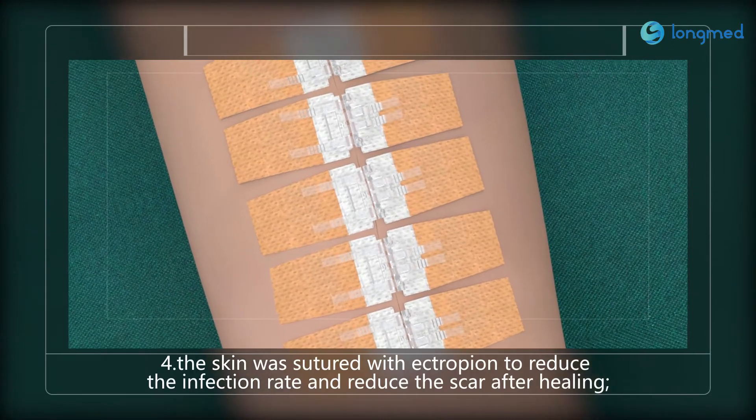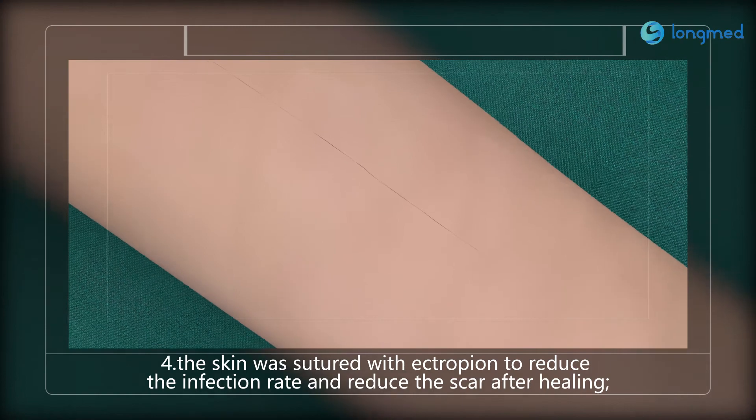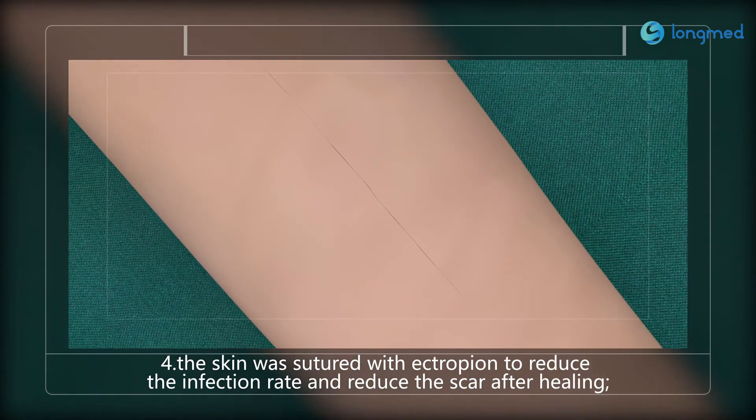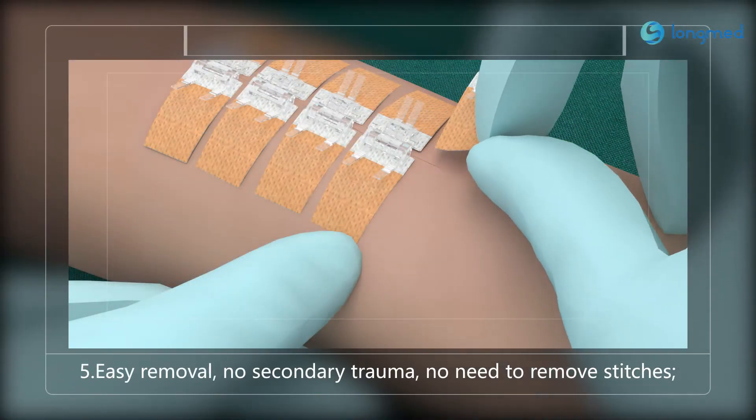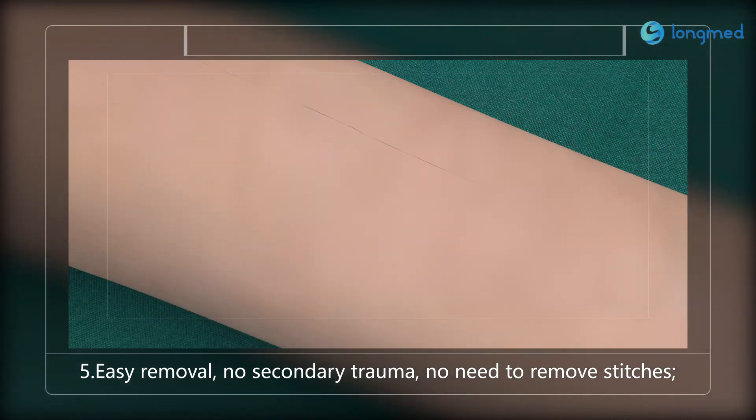Four: the skin is sutured with ectropion to reduce the infection rate and reduce scarring after healing. Five: easy removal, no secondary trauma, no need to remove stitches.